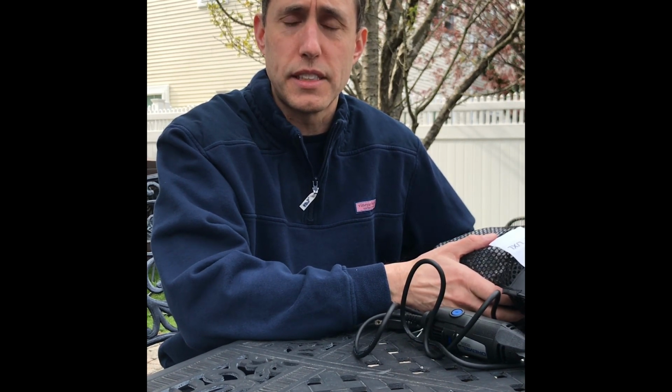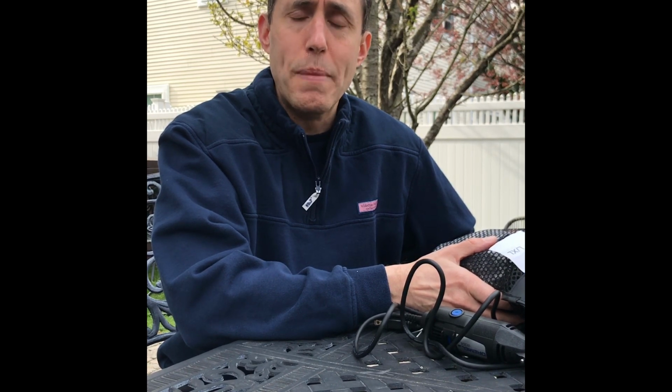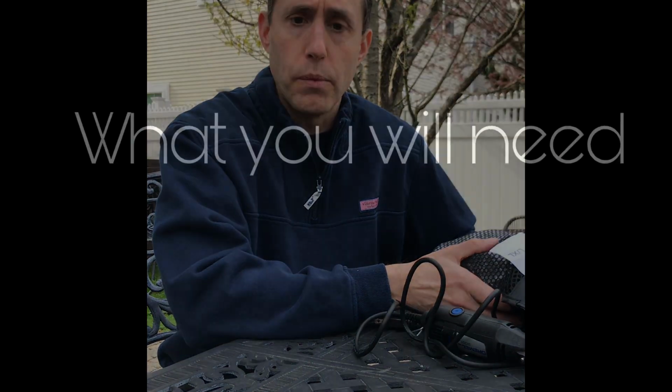I think the full face snorkel mask has at least three advantages. One is it gives you full facial protection, so it doesn't require the use of additional goggles. Second, it provides a very tight seal around the face that I think is probably much more airtight than an N95. And lastly, we can use an efficient medical filter that would be used for ventilators that should very efficiently filter out viral particles.